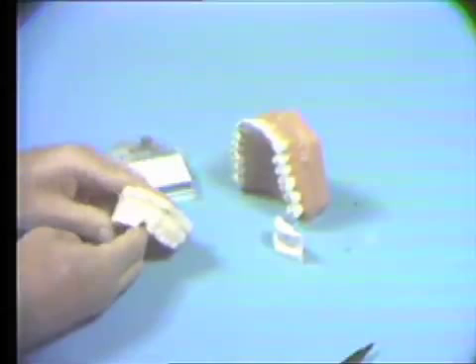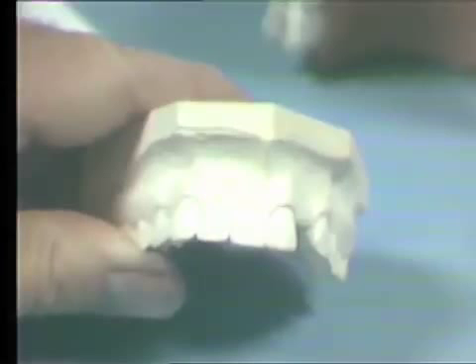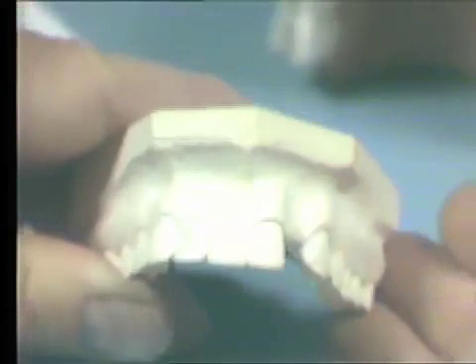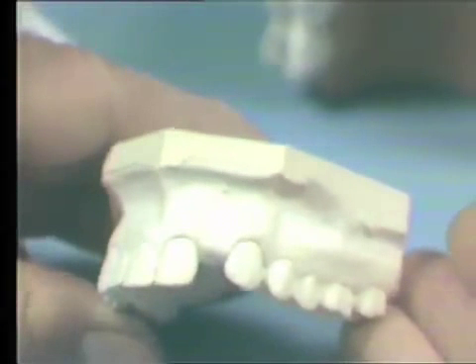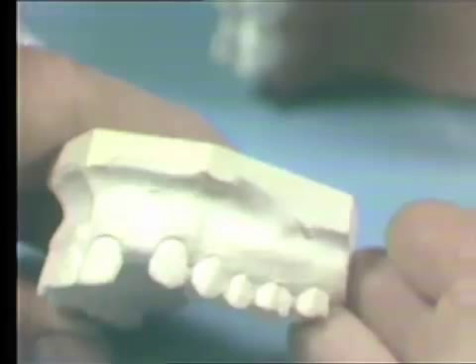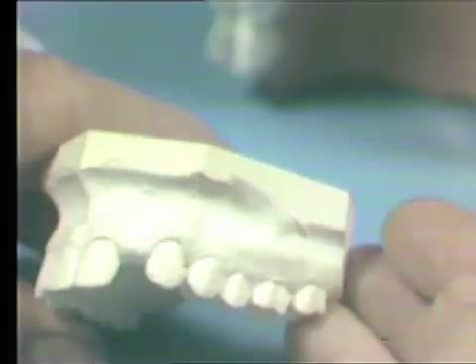Prior to starting our grinding sequence, we must analyze a case. The lateral on the opposite side of the arch, in your case, is wider mesially-distally, and therefore we cannot copy its exact shape. We'll have to develop a contour that will be harmonious with the adjacent teeth and the balance of the dentition.